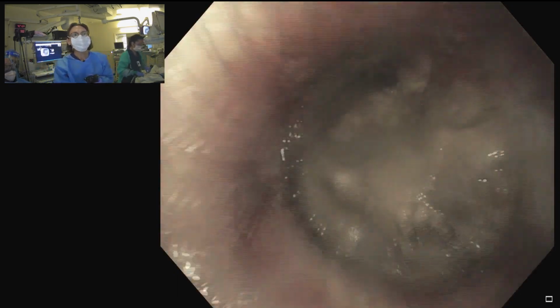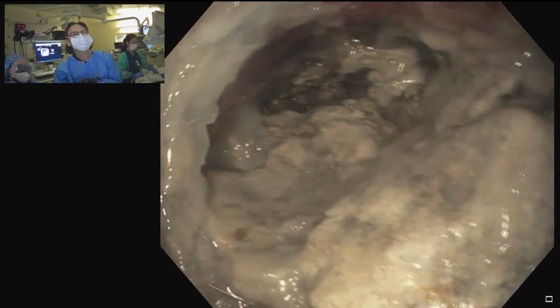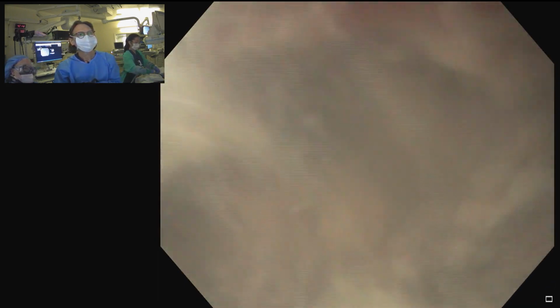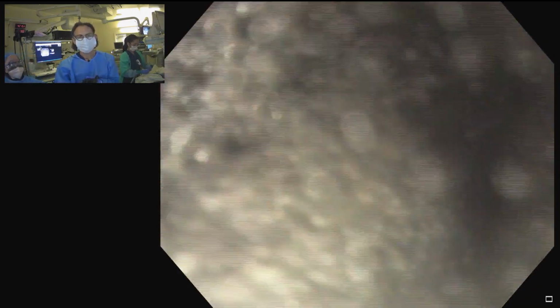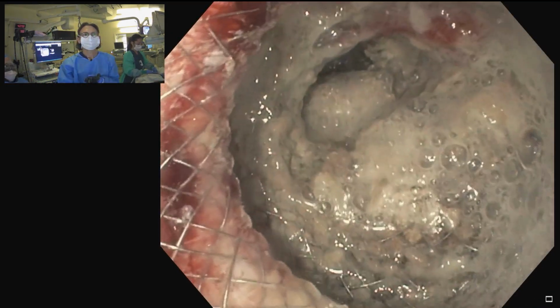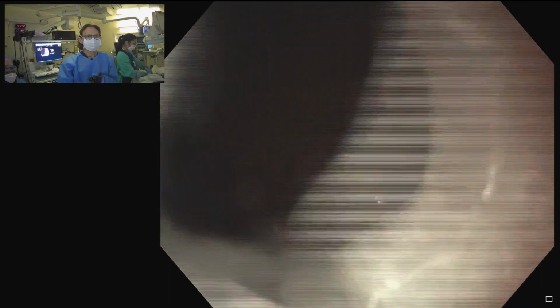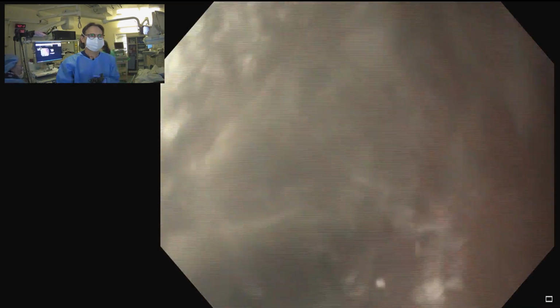Hey, Ken, the last important thing you mentioned is irrigation, aggressive irrigation. Frequently we see percutaneous drains and they inject 10 cc's twice a day. So basically they're depending on them just to drain by gravity rather than aggressive irrigation. Yeah, the problem that we have at our institution is we're recommending that, and then the interventional radiologists that place the drain are saying, no, don't put that much in. So there's this back and forth because they only use small amounts to maintain catheter patency, and we're trying to tell them, no, we want it really aggressive.